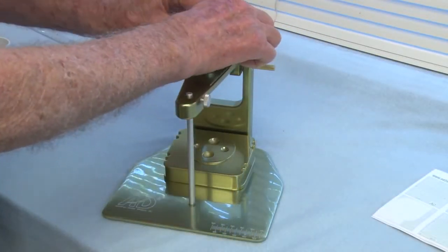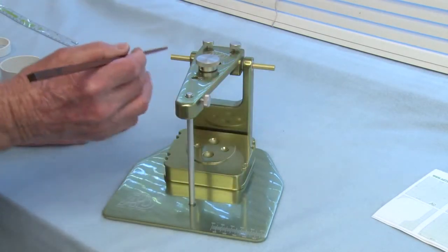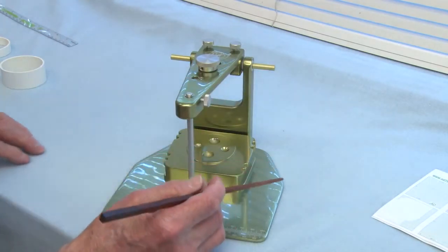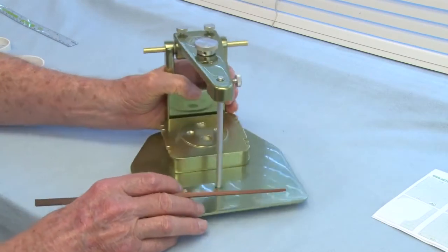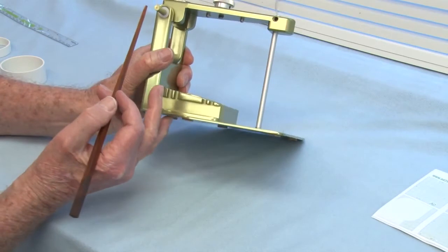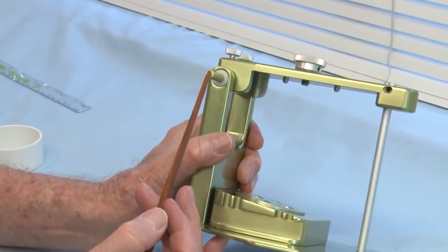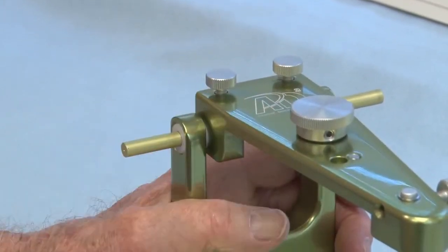When the stylus pins are all the way in so that the mark just shows on each side, if you measured from here to here, it would measure 122 millimeters. Generally, you think in terms of a 120 millimeter distance, but what creates the difference is that there's a 1 millimeter hole here on each side. So when you set your stylus pins in here, that reduces it by 2 millimeters, one here, one here, thus it's 120 millimeters.